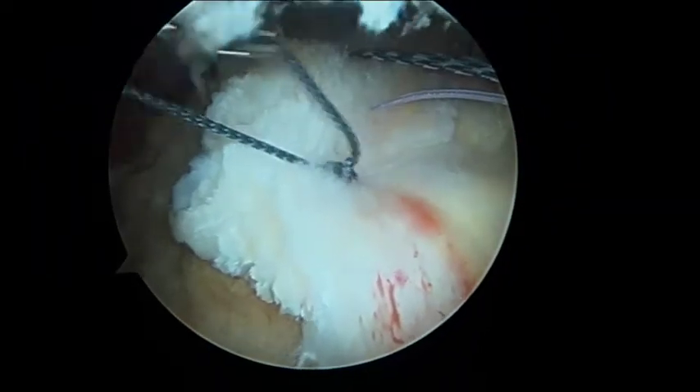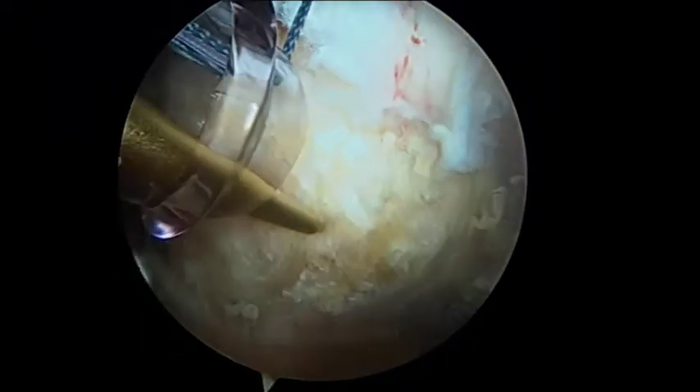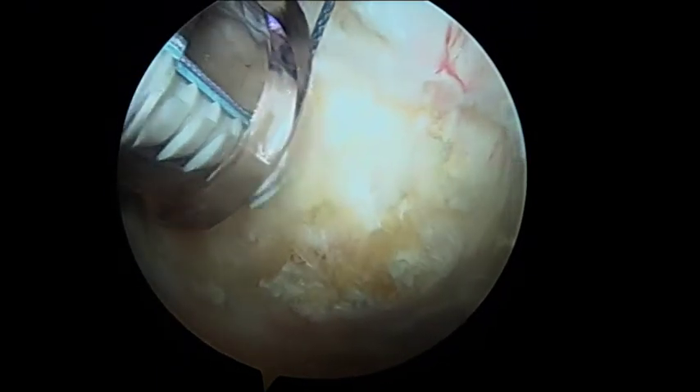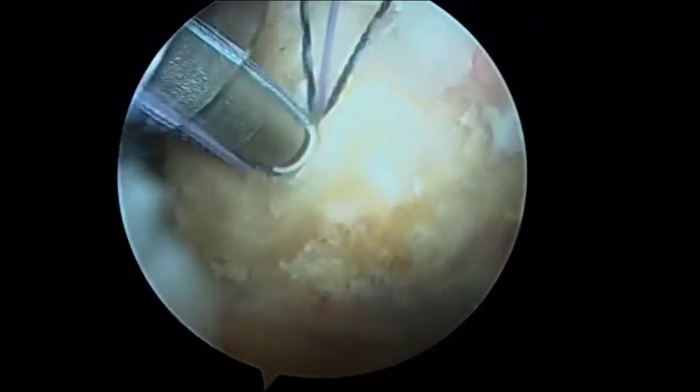One limb from each horizontal mattress suture is loaded through the end of a Footprint Ultra PK 4.5mm suture anchor. A pilot hole is prepared at the lateral edge of the greater tuberosity and the footprint anchor is advanced through the pilot hole, completing the lateral row and reducing the cuff tear.